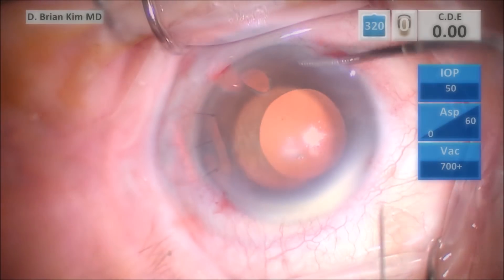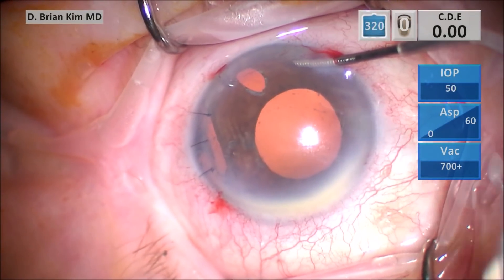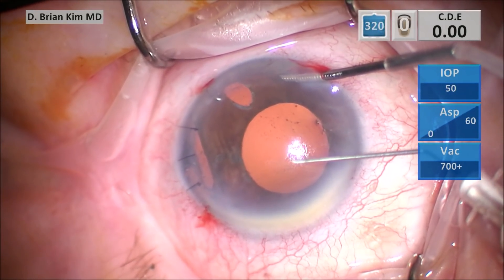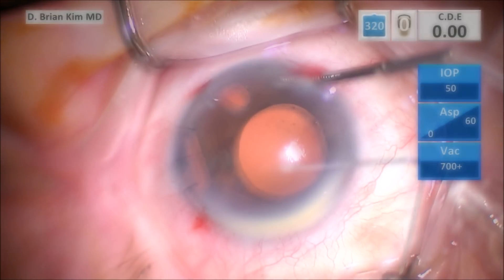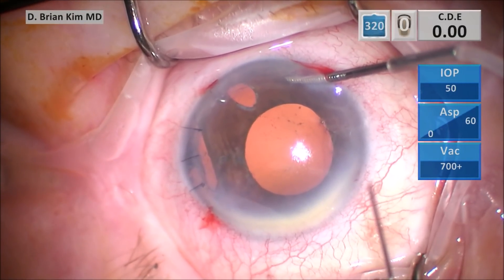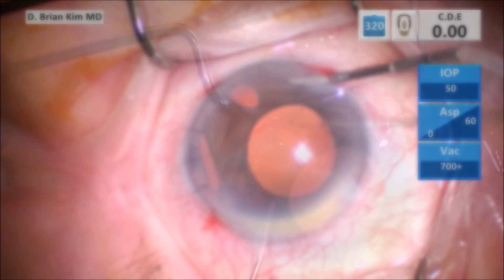I'm preparing my needles now. This is the right needle and I'm bending it about 70 to 80 degrees, with the bevel facing towards me for the right needle. Now this is the left needle. The left needle is going to face away from me, and it's bent about 70 to 80 degrees.